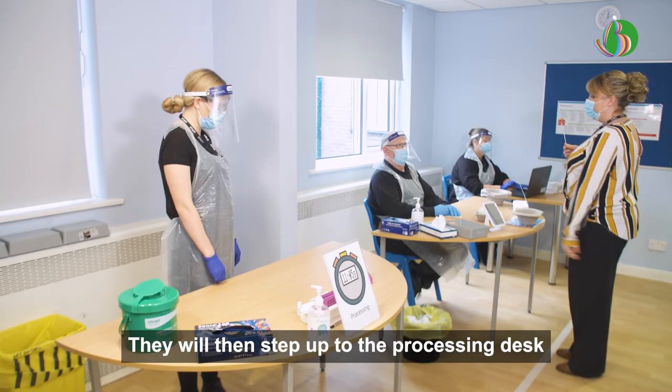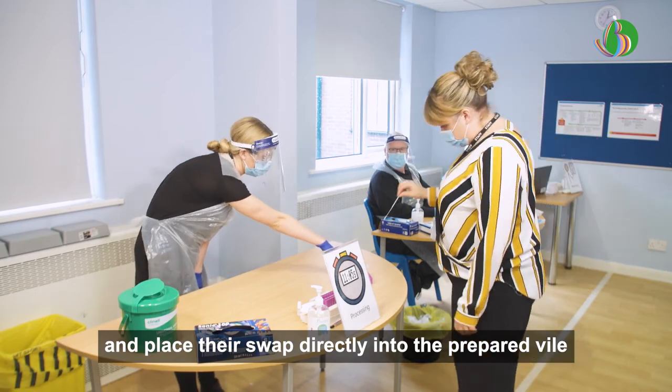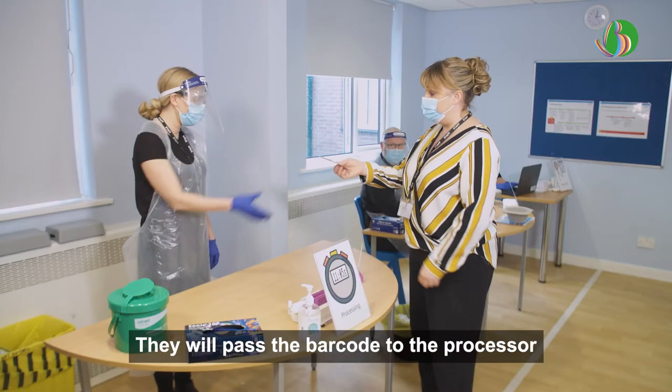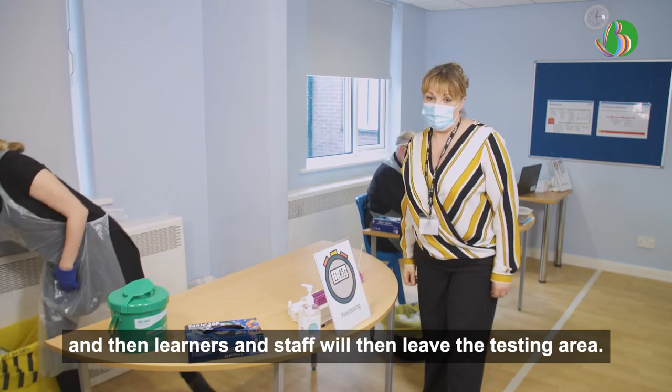Processing. They will then step up to the processing desk and place the swab directly into the prepared vial in the tube rack with the cotton bud end facing down. They will pass the barcode to the processor, and then learners and staff will leave the testing area.